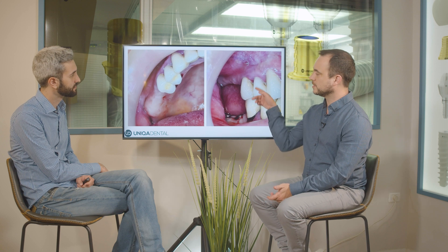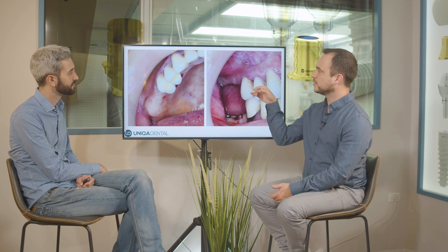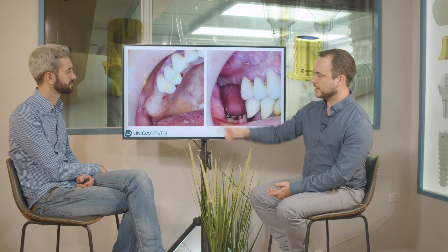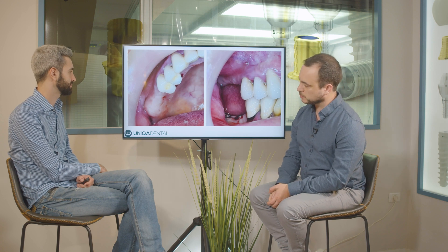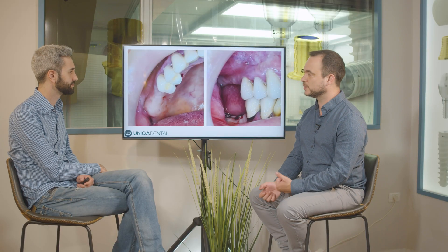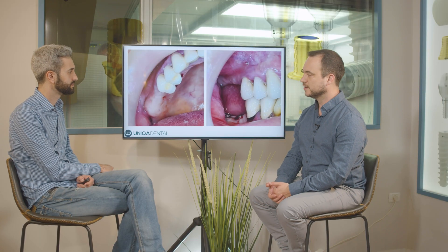You can see here the tooth with the inflammation and the fistule. In the future we'll cut between teeth 13 and 14. You can see the place where we placed two implants. Do you have enough bone? Yes, you have enough bone — we don't see it clearly on the CT, but in this case yes, you have enough bone and enough thickness.